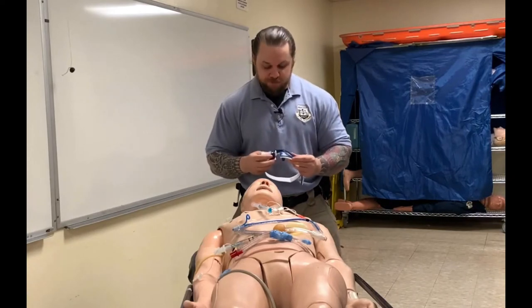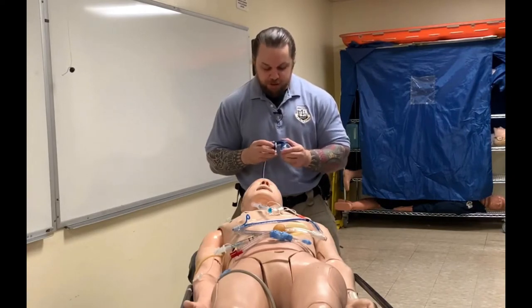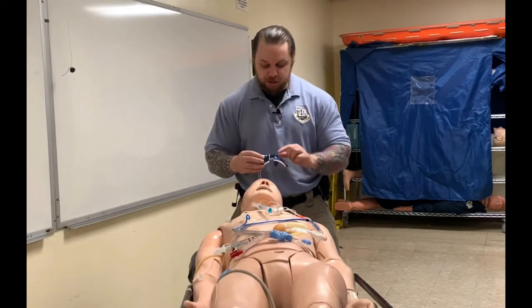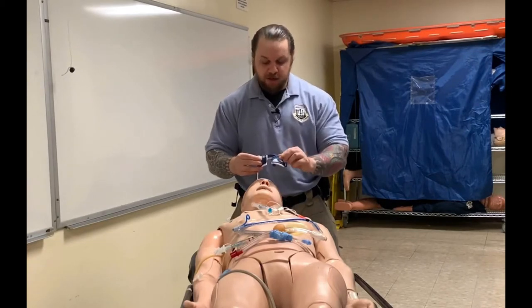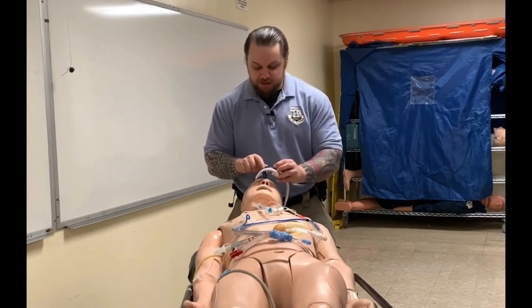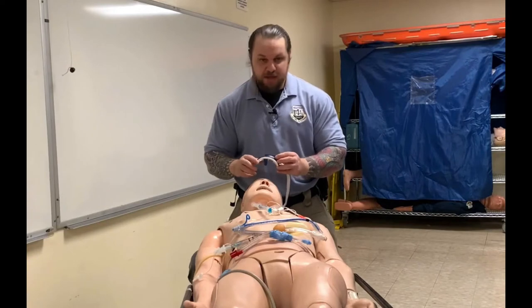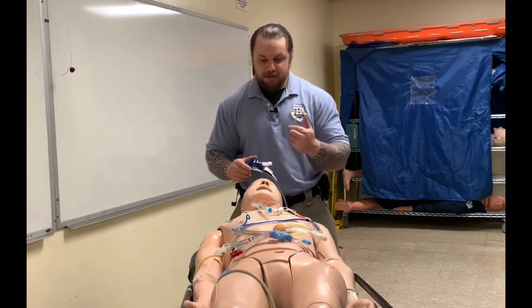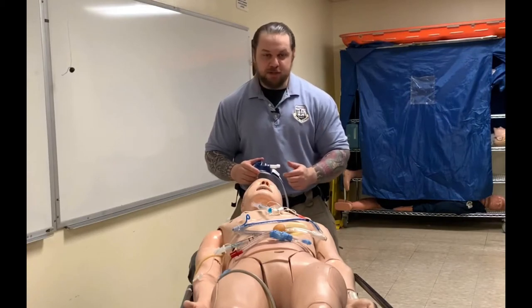This opening here is called the mouthpiece aperture, and whenever you're placing this on the patient it should always face towards the feet. If anyone tells you it should face upside down so you can read 'Thomas' legibly, they do not know what they're talking about — send them the link to this video and the instructions.